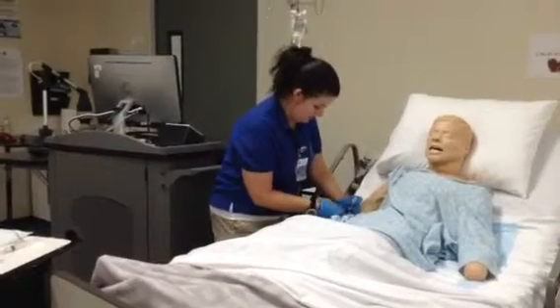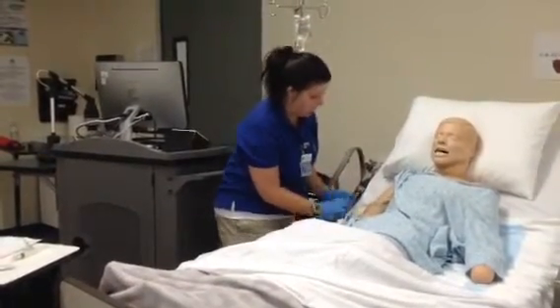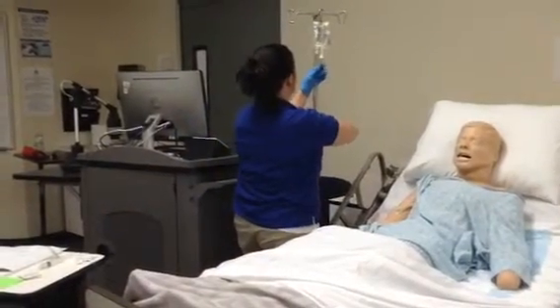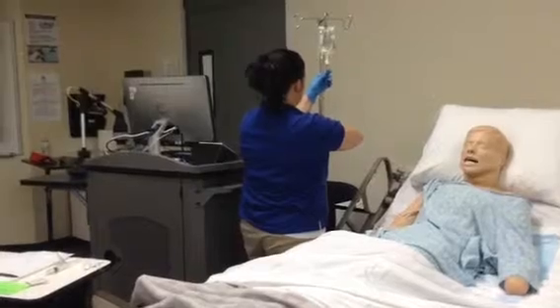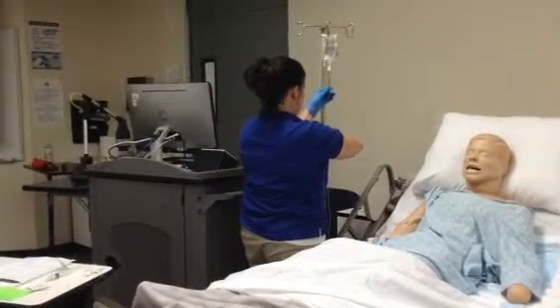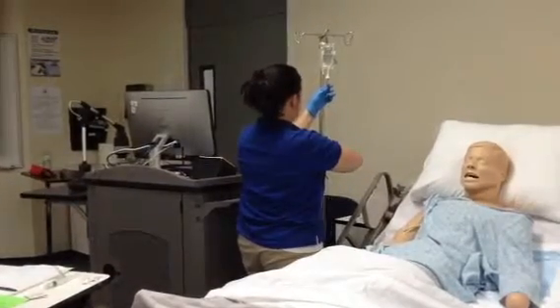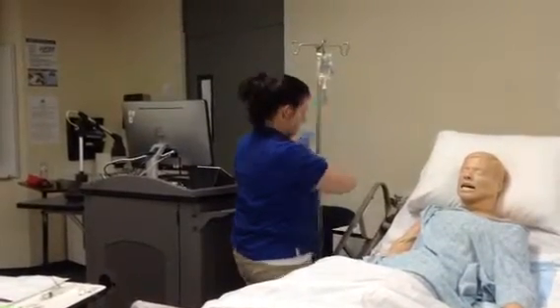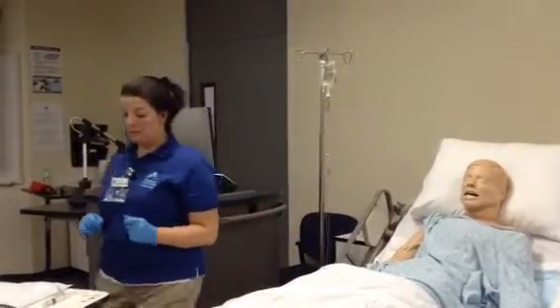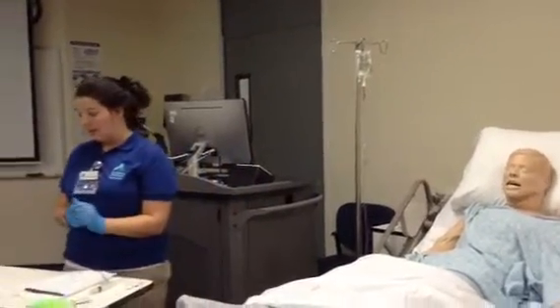I've got my medication. Okay. Alright. Okay, clamp. Make sure I'm getting 17 drops per minute. Okay, and I am getting my 17 drops per minute. Okay, let me observe my site one more time, and everything's still looking good.